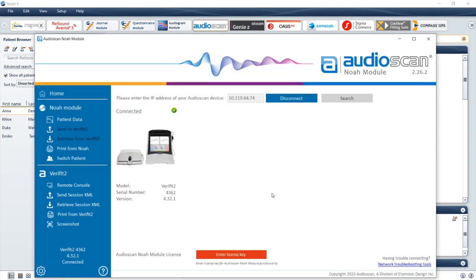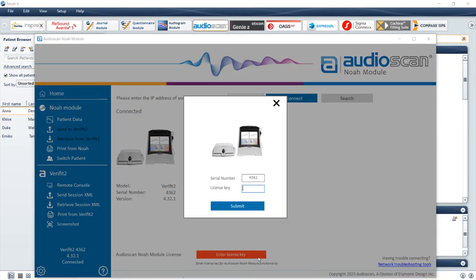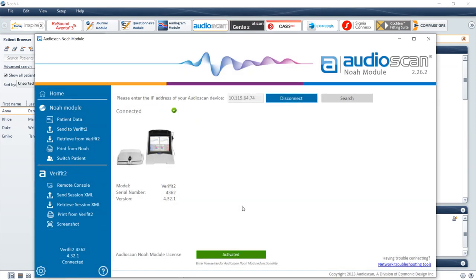Upon successful connection, a picture of your AudioScan product accompanied by its serial number will display. If it is the first time connecting your system to the AudioScan NOAA module, select the red License button and enter your 9-digit license key. Upon successful completion, the License button will turn green and show as activated.